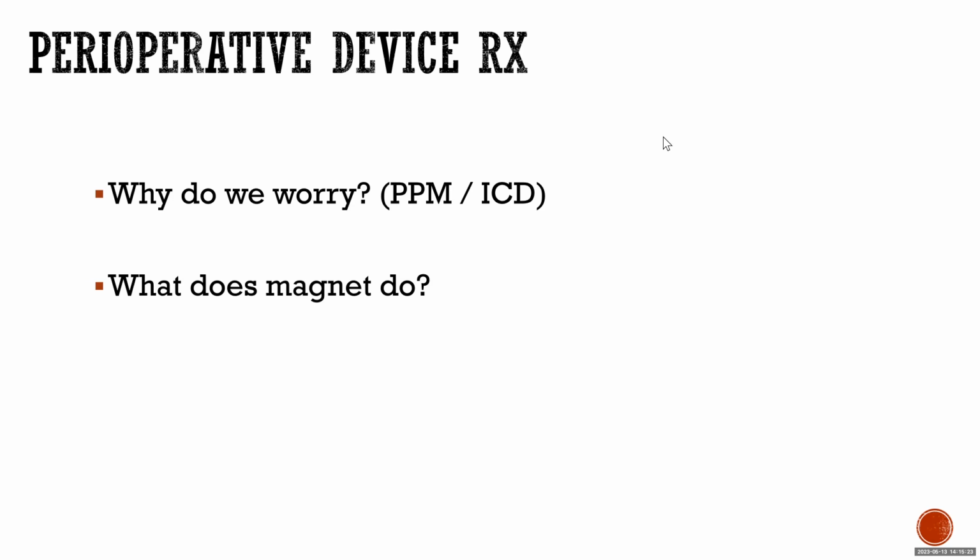So that's why we worry. In pacemakers, we worry about inhibiting pacing, which leads to asystole. And with ICDs, we worry about inappropriate shocks because of oversensing. The next thing you need to know is what happens when we apply magnets to pacemakers and ICDs.